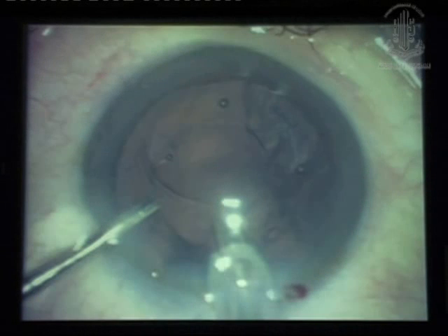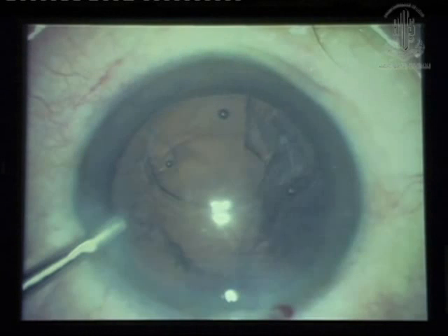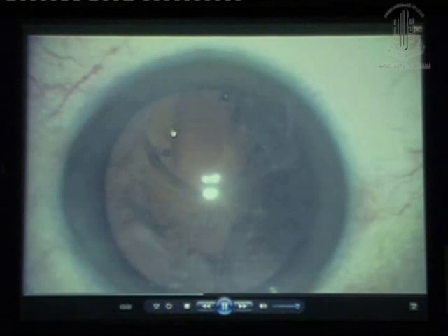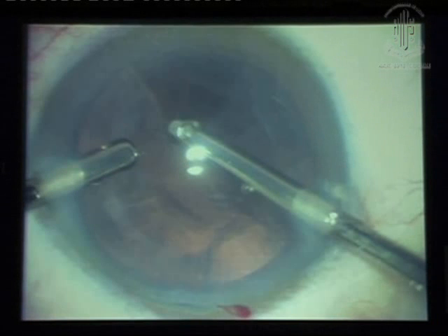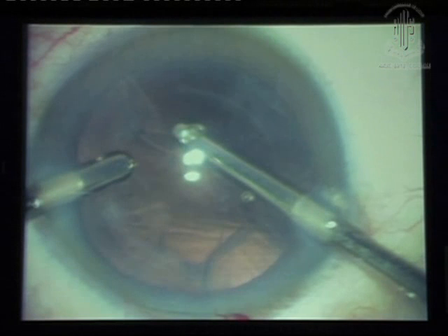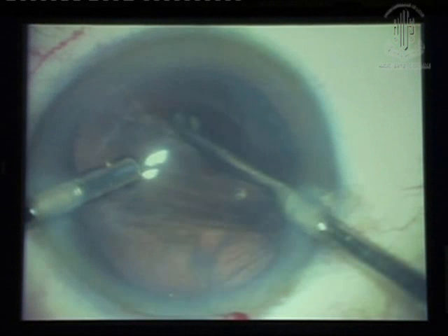and see on a higher magnification and assess the damage. Once we assess, we need to assess the damage to go in for damage control. Then take the vitrectomy cutter. Initially the cutter faces anteriorly, then you turn the cutter face downwards.